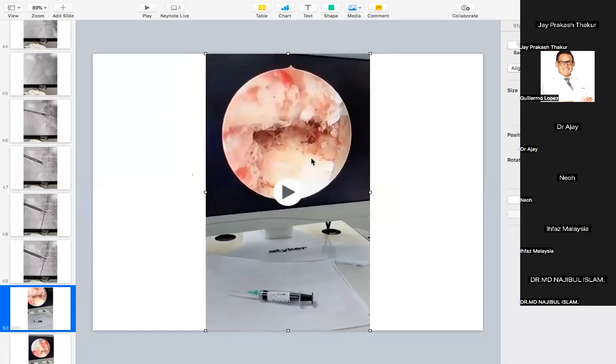So you can see here. See, there's an angulation. That's why the SAP is here. Okay, we are seeing it from the angulation, right? We are seeing it in the angulation. So somewhere here is the end plate. The superior end plate is here. Inferior end plate is here. That's the annulus. And that's the canal here. This is the SAP, superior articular process. Okay, and we are in the foramen only. In the foramen, we are seeing this, and there's extruded material over here.